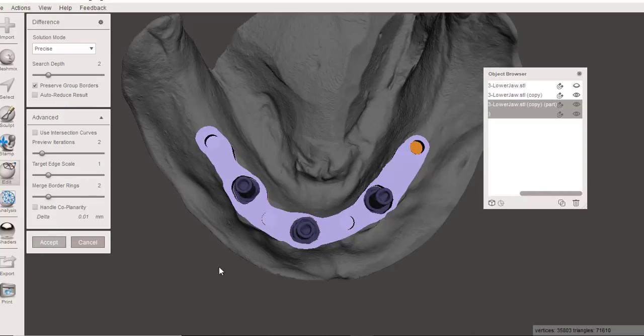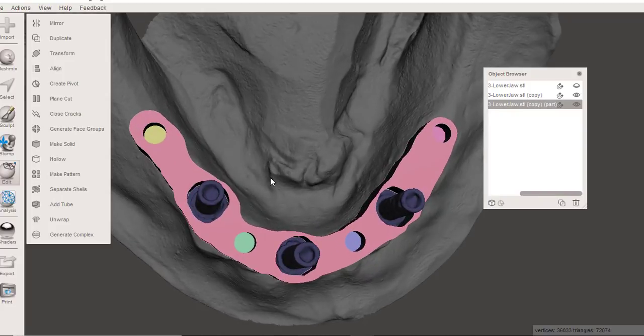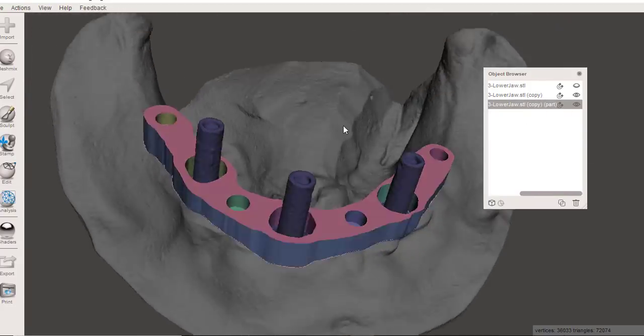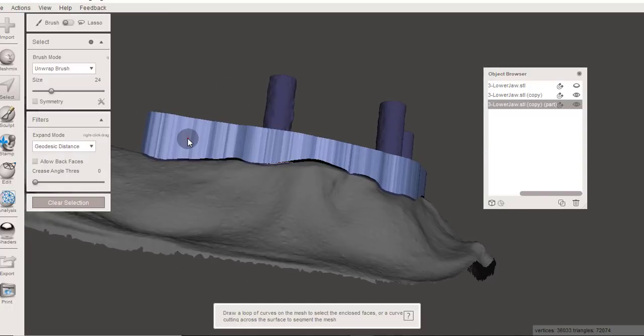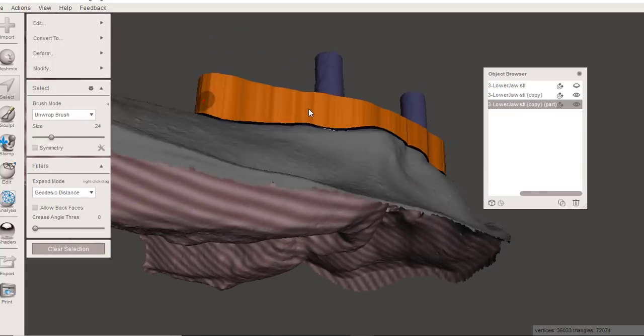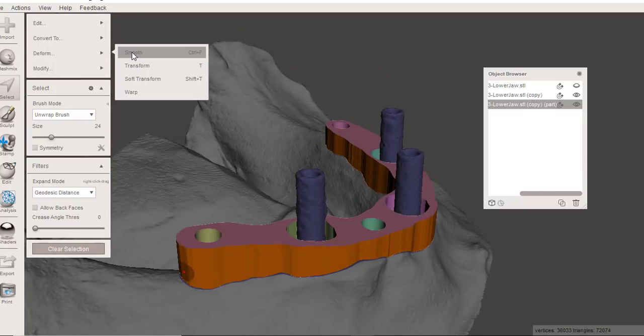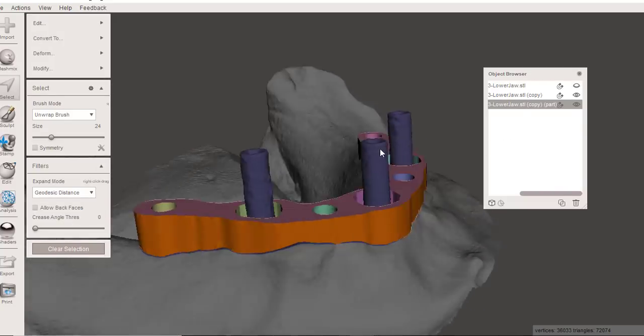And what this does is it just gives me a little well that I'm going to be able to drop in the cylinder. Now what's going to happen is I'm going to save this shape. Okay, so it's in its final form here. One thing I could do is double click on all this blue surface we extruded, and just clicking that face group I could hit modify and smooth to give this a little smoother contour. Now accept that, so it's a little bit smoother now.